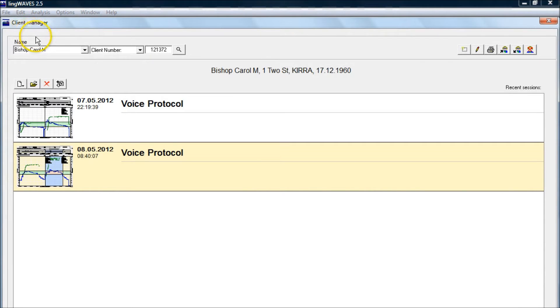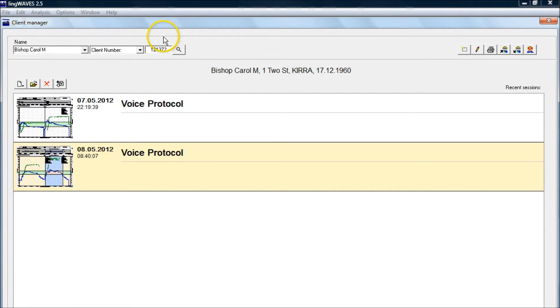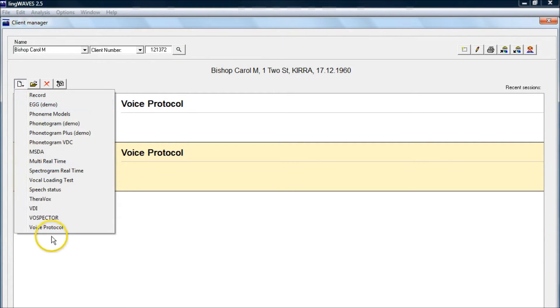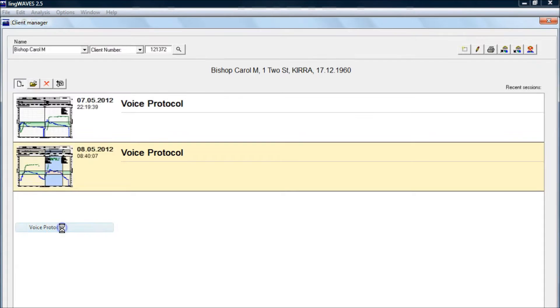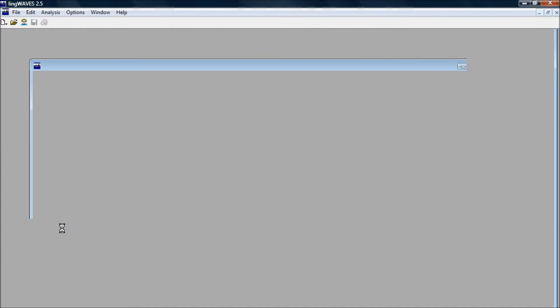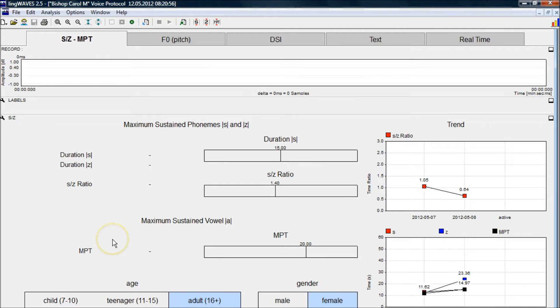Now we find our client in Client Manager. We can search by name or by file number. You can use your own medical record numbers if you like. Start a new session and start a voice protocol session.